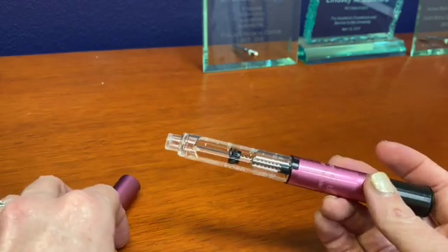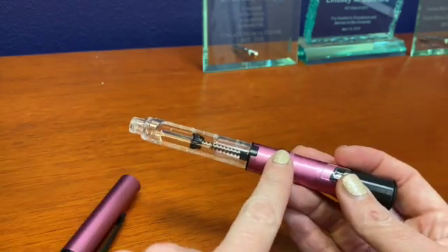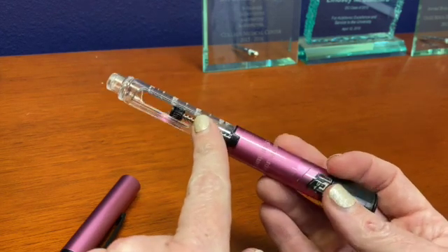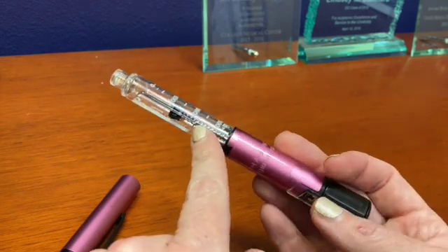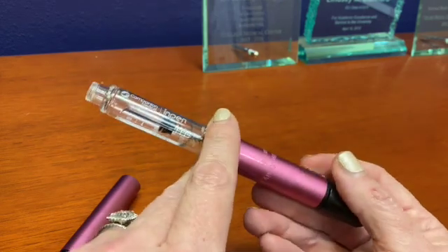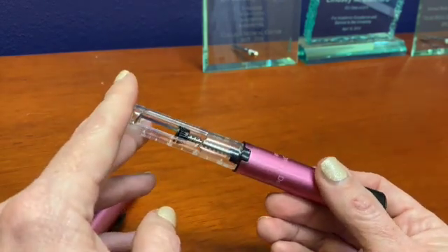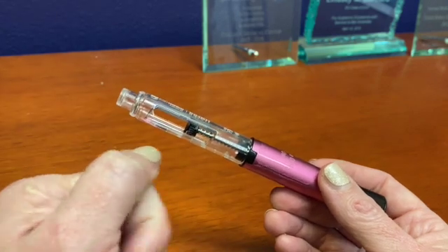A nice benefit is that this pen is going to keep track of how old your insulin is. So if your insulin is older than 30 days, it's going to let you know. And if your insulin gets warm and won't be effective, it's going to alert you so you can make a change.